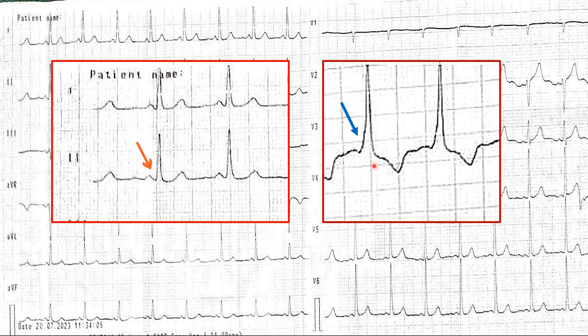In WPW, the PR is short and there is slurring or a delta wave — which is absent here. So what is the reason behind that? Is there something else going on?